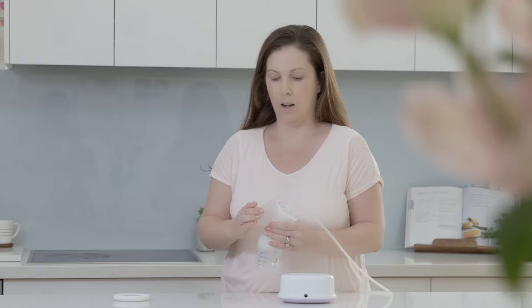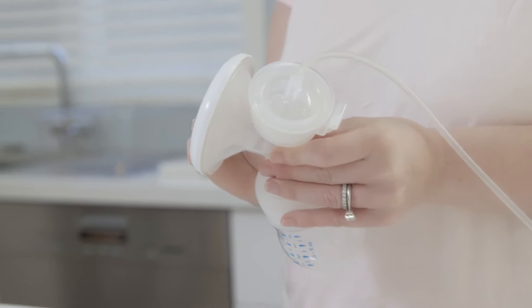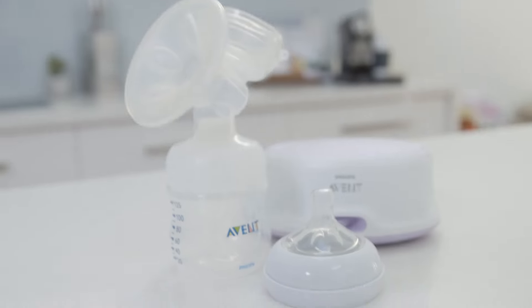That just slots on on top, and then if you're expressing and need to put it away but don't need to give it to your baby for another half an hour, there's this cap, which is a really good feature. It sits on top and you can leave it like that, or you can attach the top of the bottle and put the cap on top and leave it out for half an hour — it's fine.